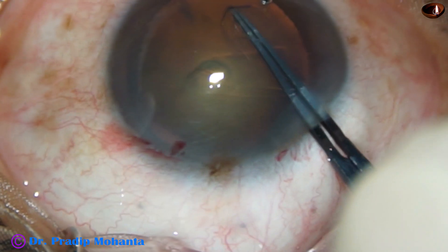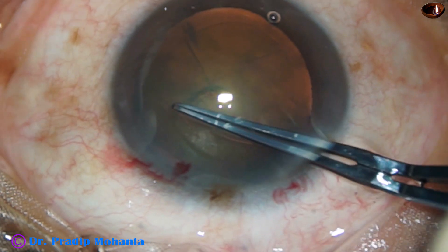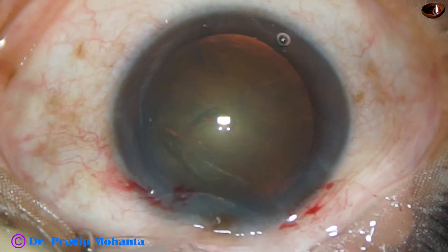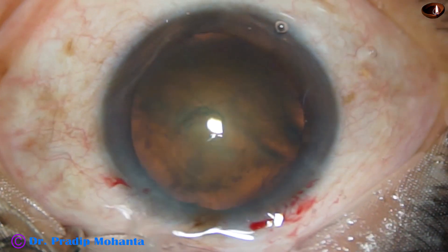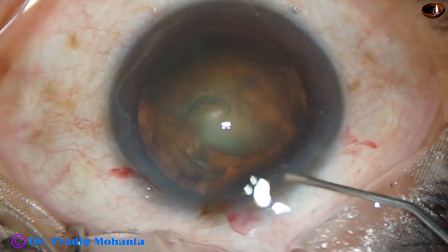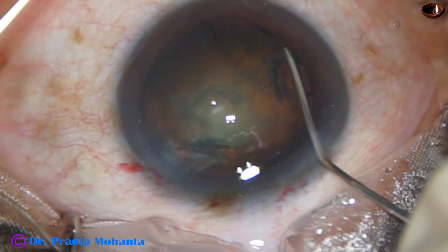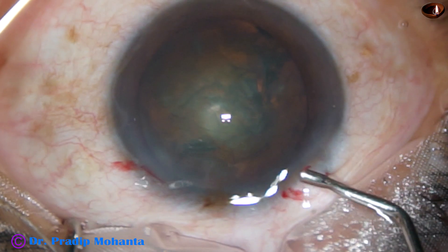The capsulorhexis is being done with the help of Utrata forceps. All these steps are just like any routine case, which we have done thousands of times. Now hydrodissection is being done after expressing out some visco. Hydro-delineation is attempted, but no golden ring formed in this case. And now some more visco.